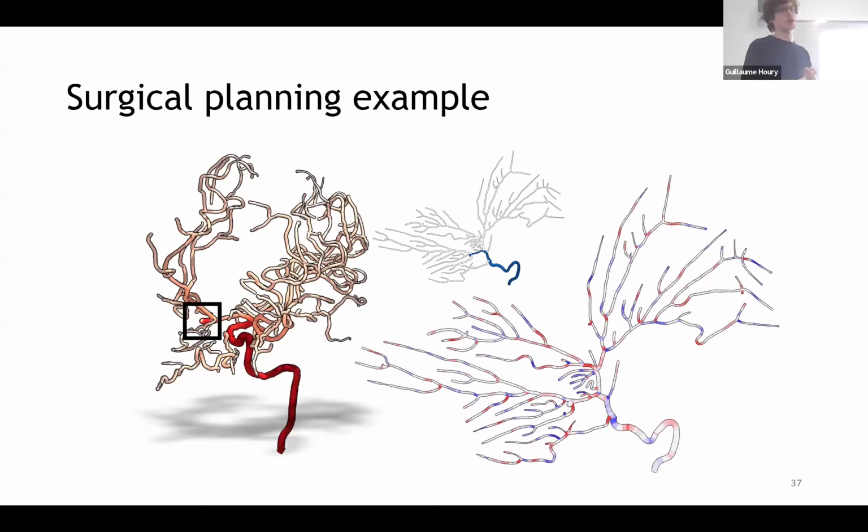But for clinical purposes, we are actually interested in a smaller part of the whole brain system because the targeted locations are way closer to the origin than what was shown before. So we can just restrict a bit more which part of the brain we are working with, which makes the visualization more accurate in terms of curvatures because we have fewer branches to stack on the embedding plane.